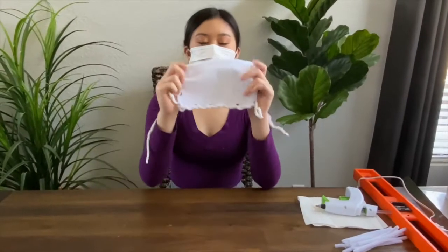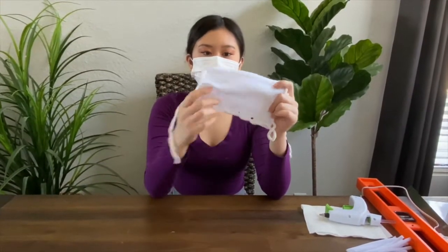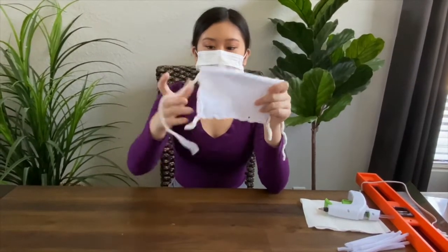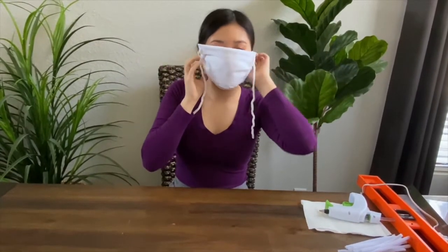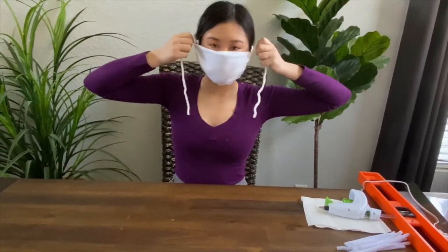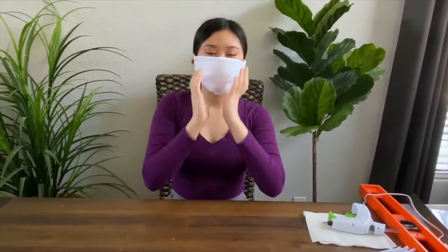So once you're done, the mask should look something like this, with the yarn threaded through the holes and the folded top part. So how to put it on: those spaces you made at the bottom for the ears, you put those on. To adjust it to your face, first you're going to tighten the bottom. And then after you tighten the bottom, put it around the ears, next thing you're going to do is tighten the top and then tie the strings around the back of your head. And then now you have your mask.